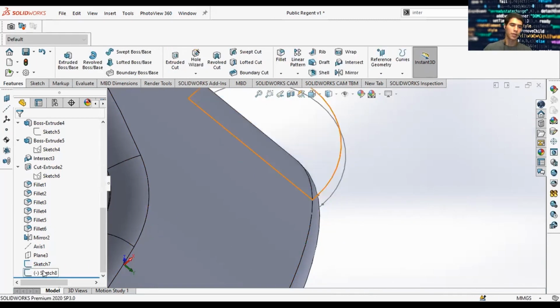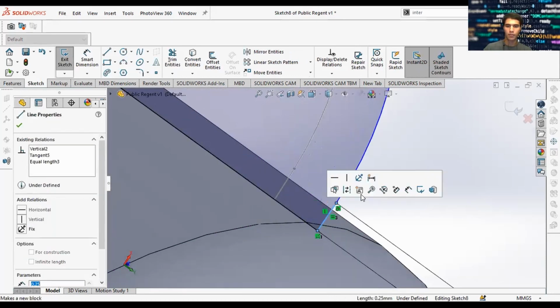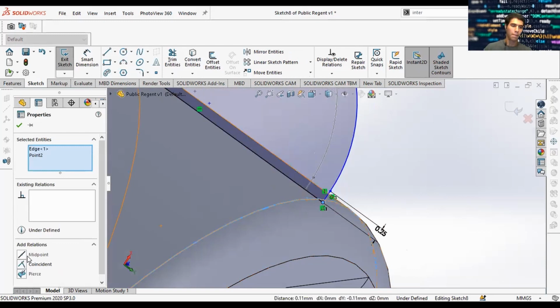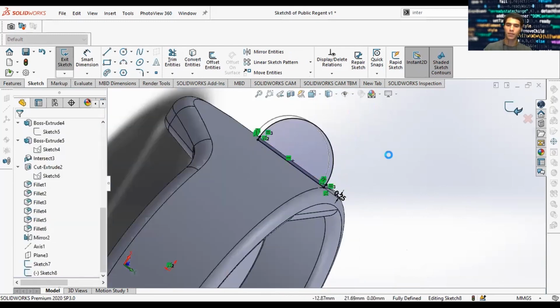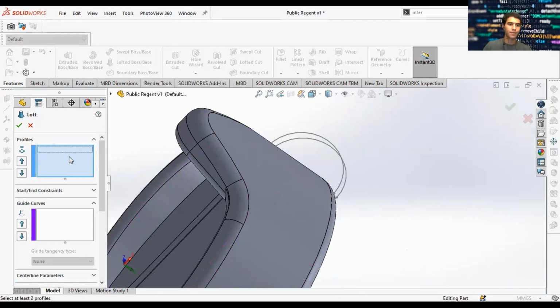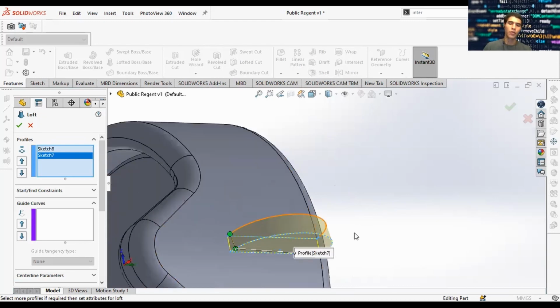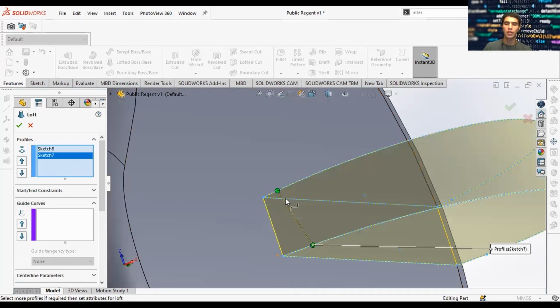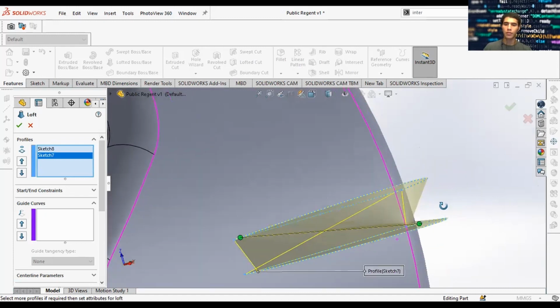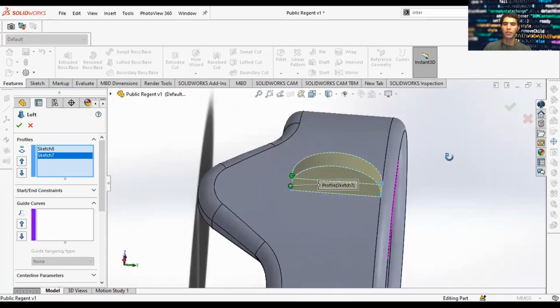That looks good there. And check our second sketch. How many connectors do we have here? We have 4. Let's set this constraint to this line. Coincident. So now it's fully defined. Let's do our loft. All right. And since it's fully defined, the connectors are aligned. So before it was misaligned, but now you can see the connectors here. These would be the green dots. These connectors are aligned. And you can add or remove connectors if you wish, or you can even click and drag the connectors to a different portion of the sketch, like this one. See how the connectors are misaligned now? You would have one connector all the way over here and the other one on the other side of the sketch. Bring it back and that would align the connectors.